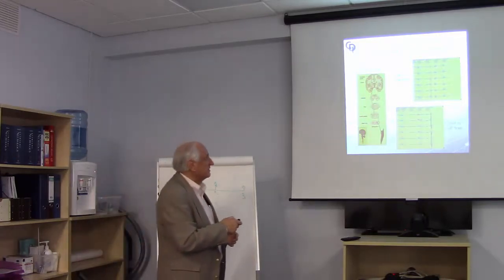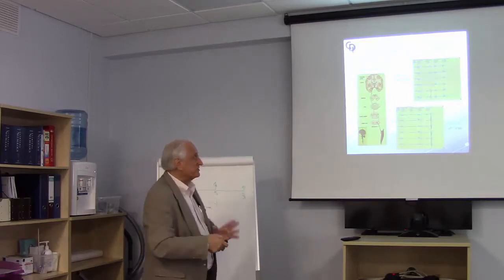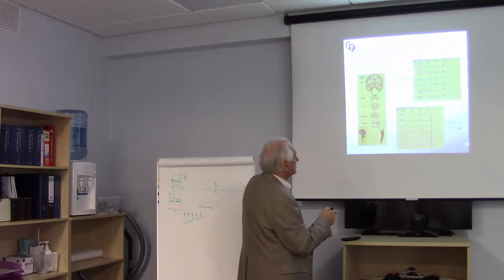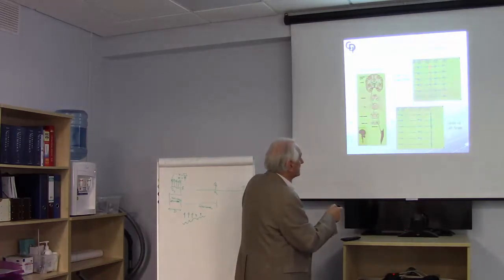So here you can see the anode on the right brain, and we're getting muscle responses on the left side, just as you would expect. I think these are a second apart. If you can see the times, you can see the burst of stimulus, and then the evoked compound muscle potential from the transcranial stimulation. So upper extremity, lower extremity, nothing from the muscle groups on the right side.